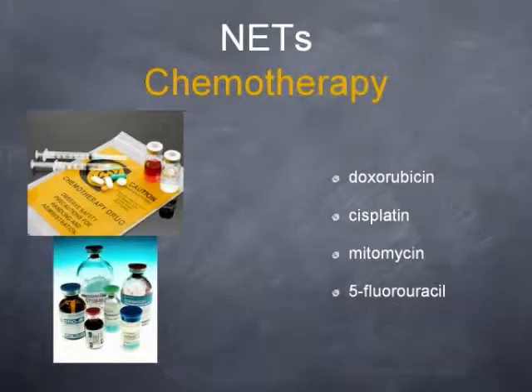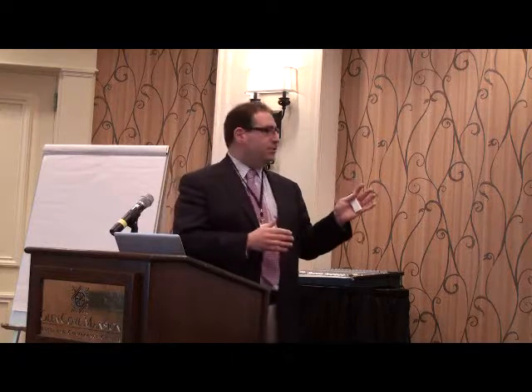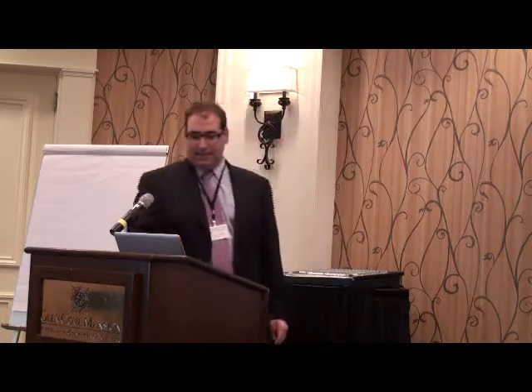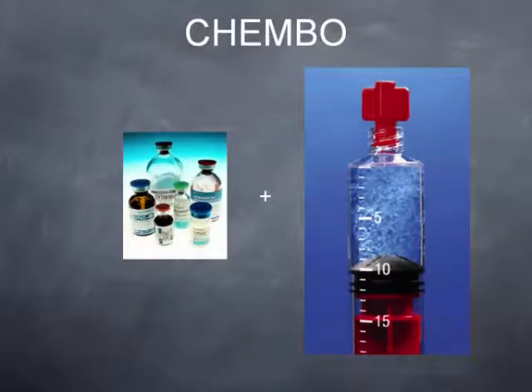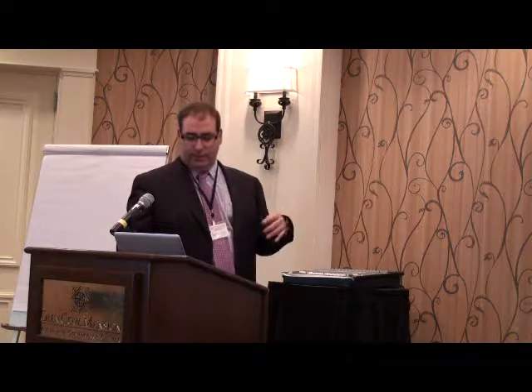But we can also mix those particles with different chemotherapies and possibly get more bang for the buck, because we can deliver much higher doses of chemotherapy in a catheter-directed fashion directly into the tumor blood supply, and not only get chemotherapy into the tumor, but also block up the blood supply at the same time. And that's called chemoembolization, or what we call chembo, chemotherapy and embolization. And basically by combining the two, we can treat different tumors.